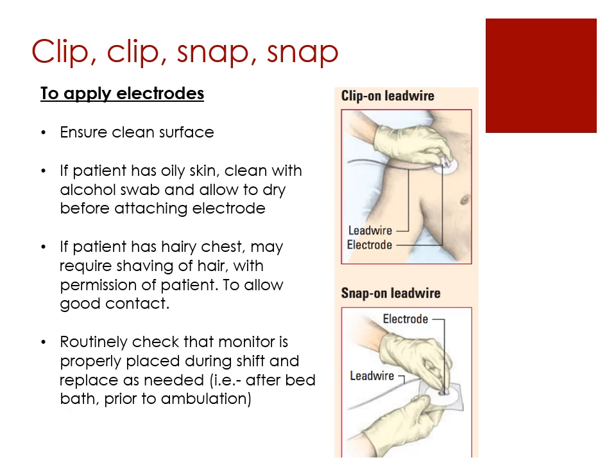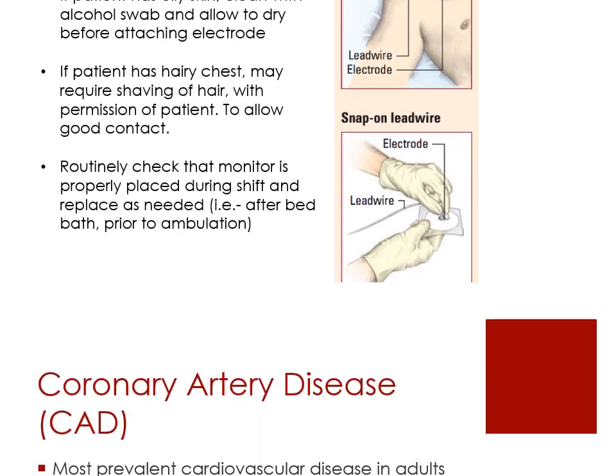There is a monitor tech who will tell you whether it's working or not, and they'll tell you what the rhythm is. So always check with your monitor tech, make sure that the telemetry is correctly placed on there.